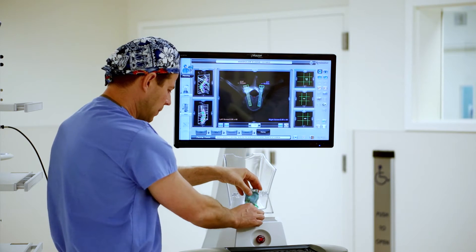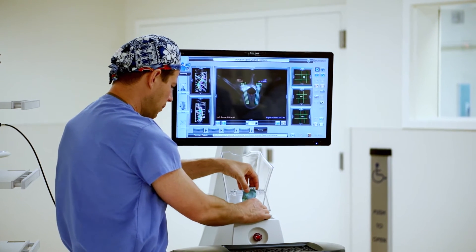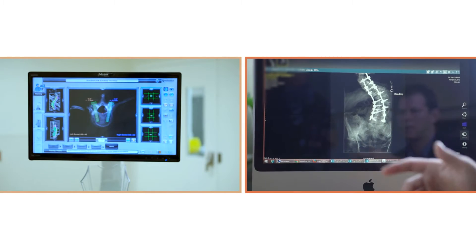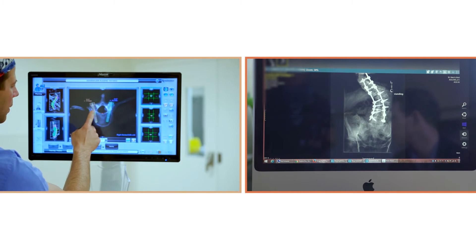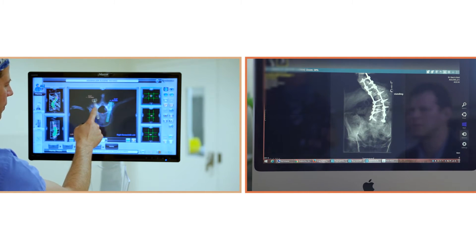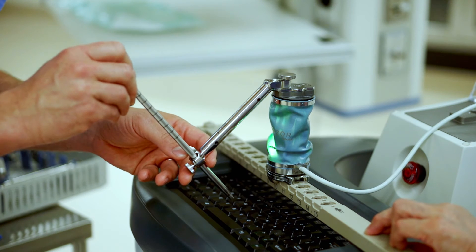When the patient is positioned on the operating room table, I load that plan and the CT into the computer in the operating room. We then have to tell the system that the CT belongs to the patient who's actually laying there. There's a process of merging data acquired in the operating room with the data acquired beforehand in the form of a CT. It serves as a guide for the drill.